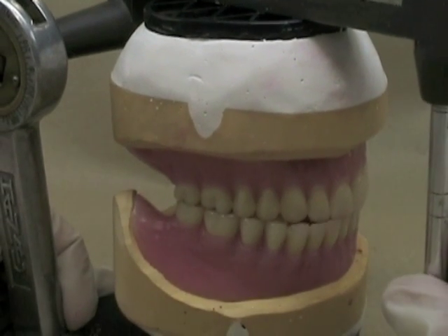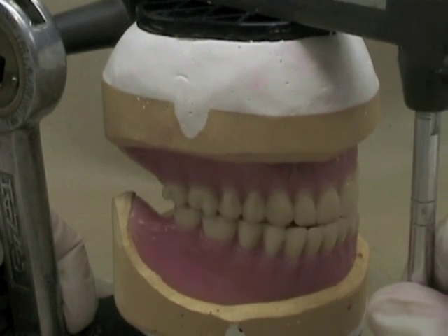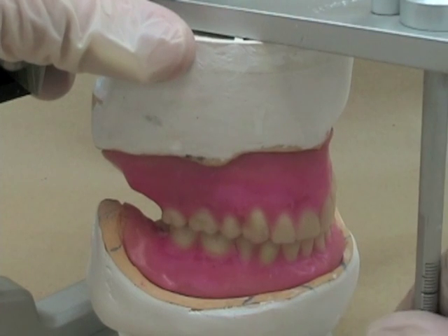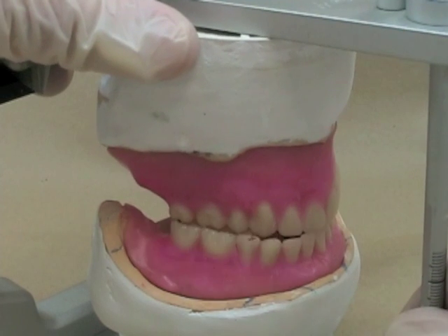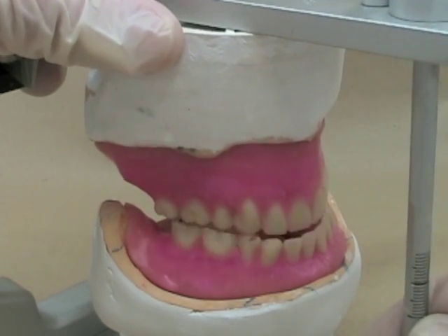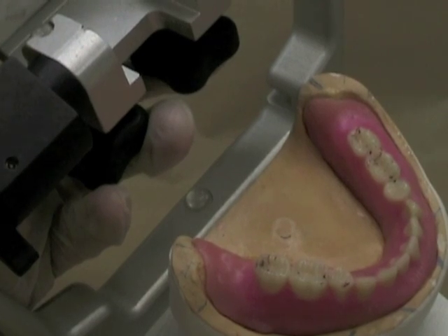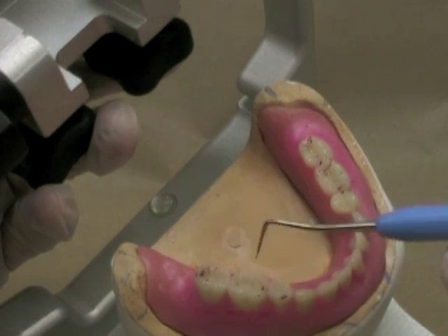Our final goal for our excursive contacts is that when we make those movements in excursions, it shouldn't be bumpy or jumpy. You can see here that my articulator moves very smoothly into different excursions. Note the difference with this unadjusted occlusion — you can see it's jumping here, it's a little bit bumpy, you can almost hear it jumping over some of the cusps. We're going to smooth those out with our excursive adjustments. You get those jumps and bumps when you don't have nice smooth lines on all of the teeth.